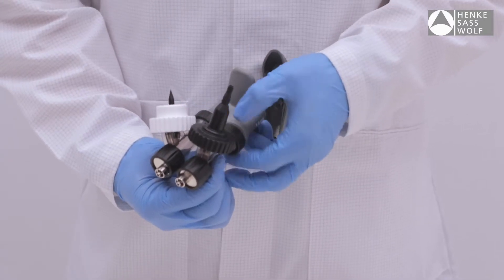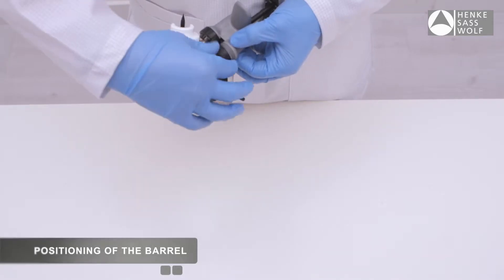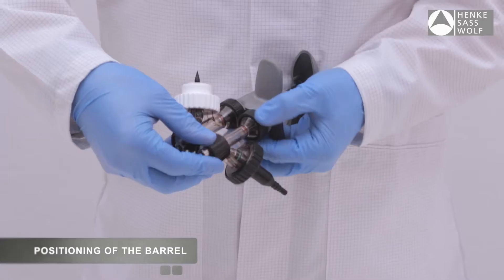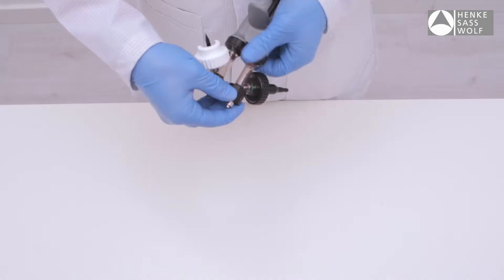Turn the adjustable barrel collar while holding the barrel to loosen. Once loose, you can adjust the barrel position as required. To tighten, hold the barrel in position and tighten the barrel collar.